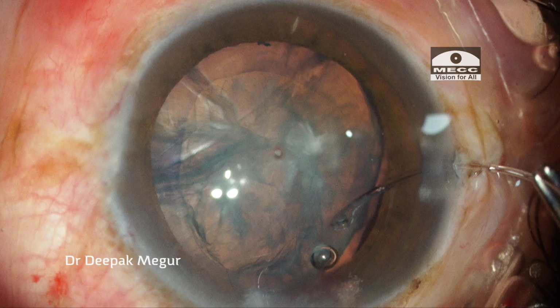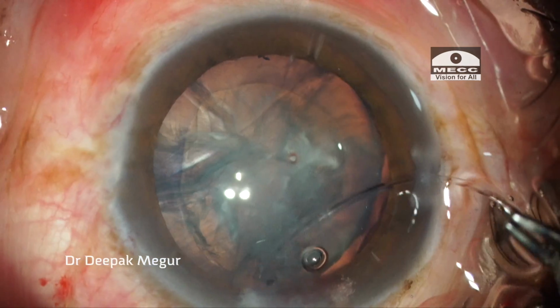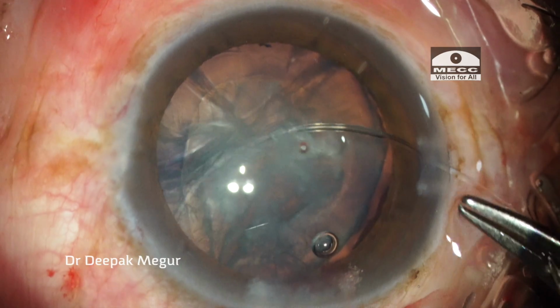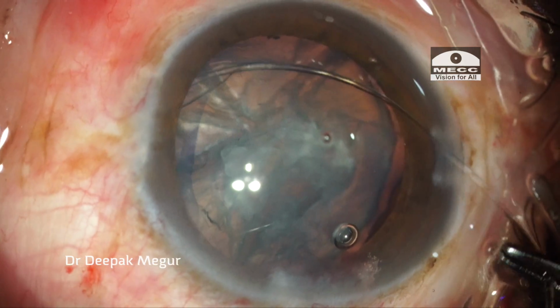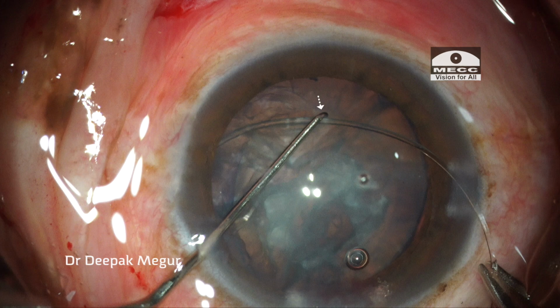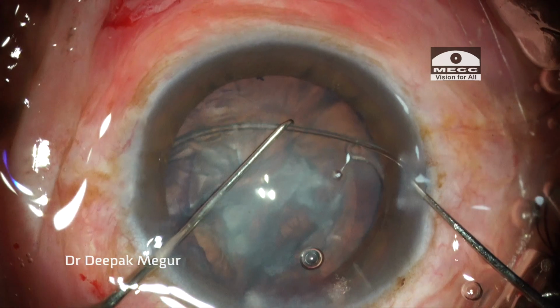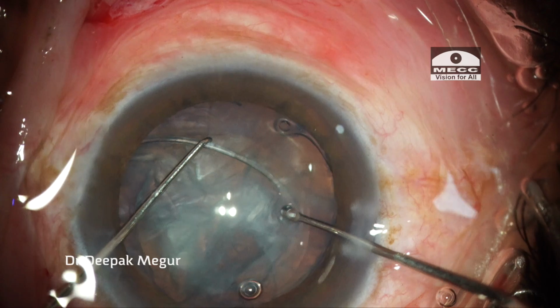The CTR is gently introduced into the subcapsular space which has been created. Once in the space, the ring is pushed progressively in a plane parallel to that of the capsular bag. The ring is now seen traversing across the region of the zonular dehiscence. A Sinskey hook is introduced through the non-dominant hand, and this supports the ring while the ring is being dialed gently into the bag. The bimanual technique helps me to control the process of CTR insertion pretty well.